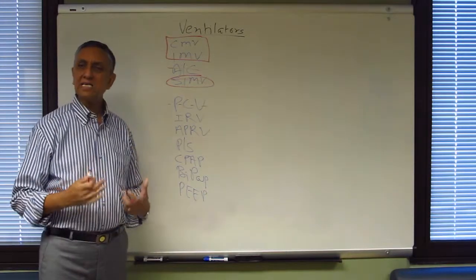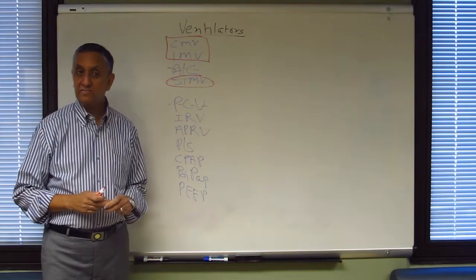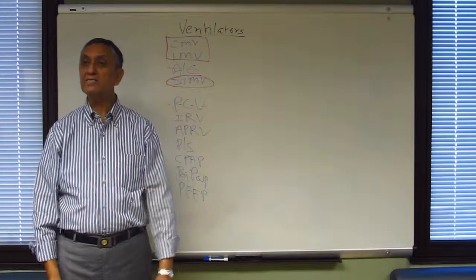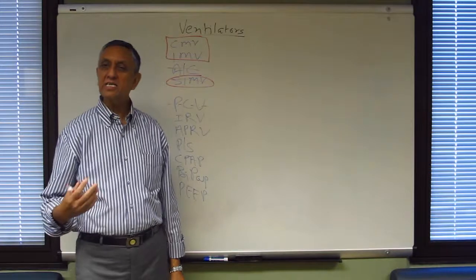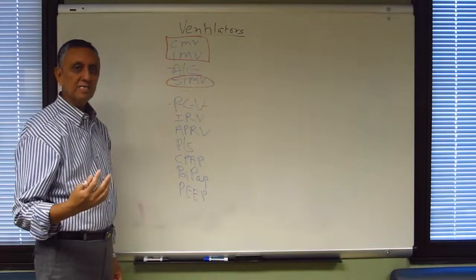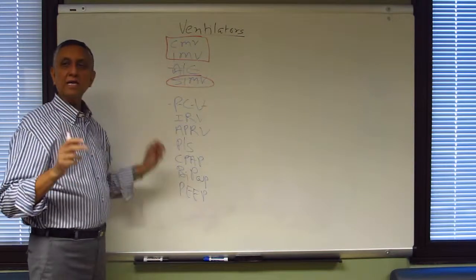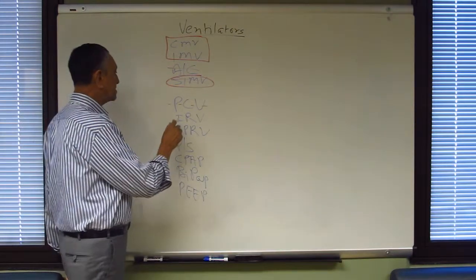It's not exactly a very physiological way of breathing. The easiest way to describe it is if I put a pillow on your face and ask you to breathe. That's how it feels. So you should sedate such patients and not have them awake and uncomfortable with the breathing. What is IRV?